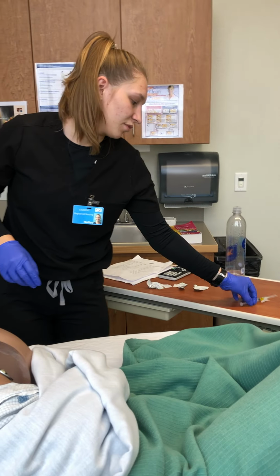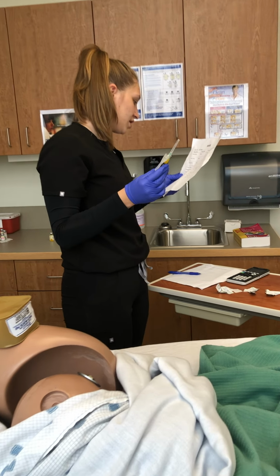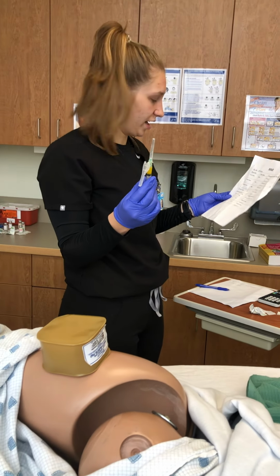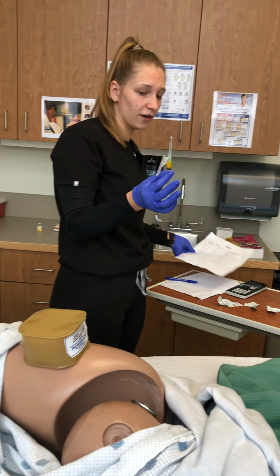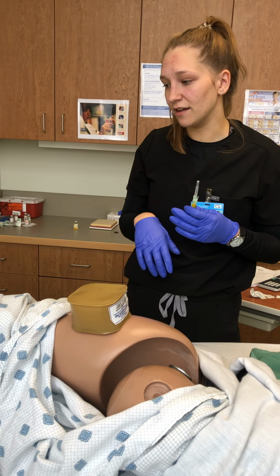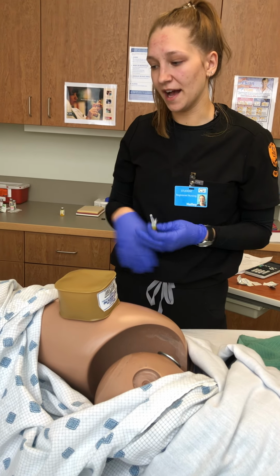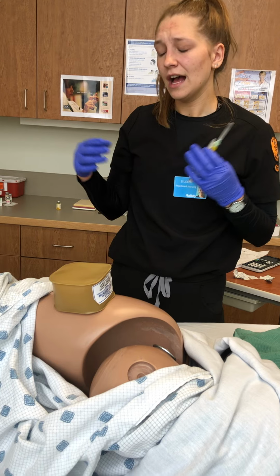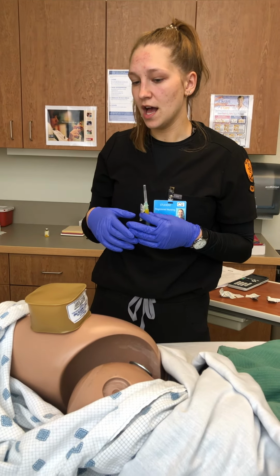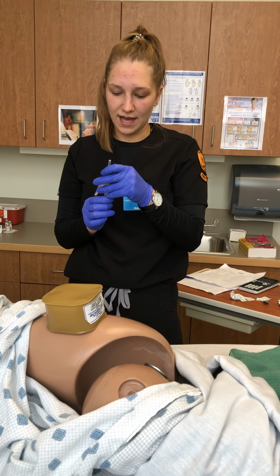While I'm letting that dry, I'm going to do my third medication check. My ampicillin, I have 330 milligrams per milliliter. I have 1 milliliter in here, which is approximated to 330 milligrams, so I have the correct amount. I've verified the correct client, the correct dosage, the correct rate of time, the correct route. I'm going to go ahead and document afterwards. I've educated her on it. I've explained to her why she's receiving it. She knows she has the right to refuse, and I'll come back and evaluate her later. But I'm going to go ahead and uncap this.